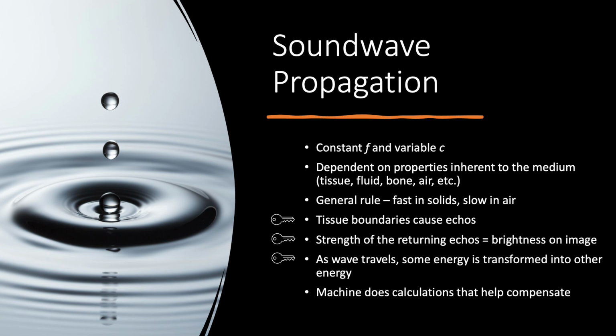So we've all heard the fact that sound travels faster in water than it does in air. And that's because of the elasticity of water. Water is much less compressible than air is. And for that reason, sound travels much more quickly through it. For the same reason, it's faster in solids rather than it is in liquids and in air.